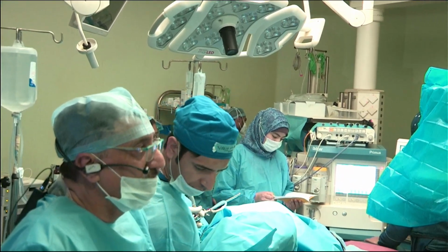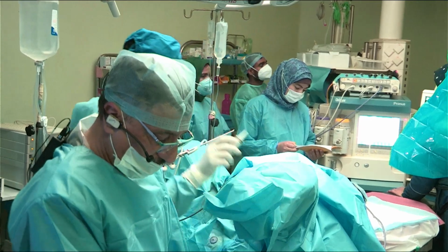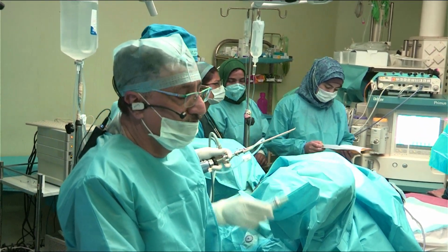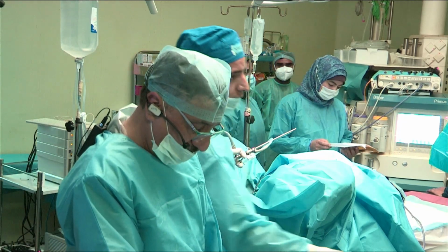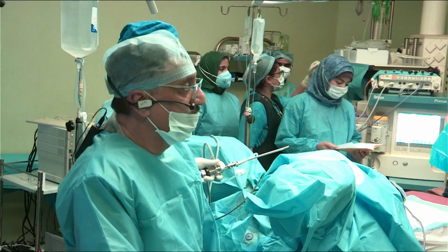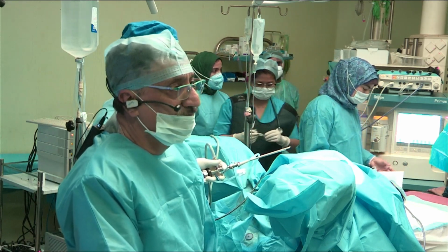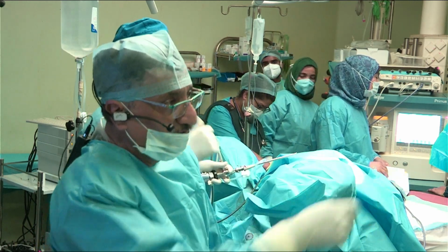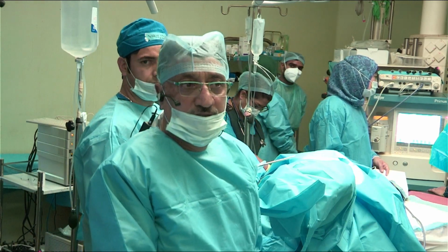We will be live telecasting two cases. One will be from OT3 and the second will be from OT2. From OT3, we have the honor to introduce Professor Syed Sajad Nazir. Sir will be doing RIRS on a patient having nephrolithiasis. Sir, you are live to us. With this, we start the Valley Eurocon.